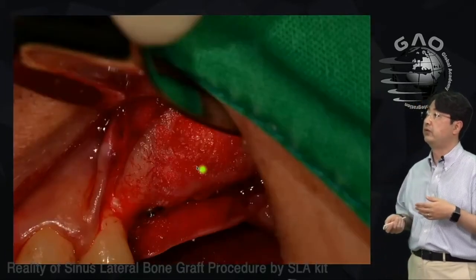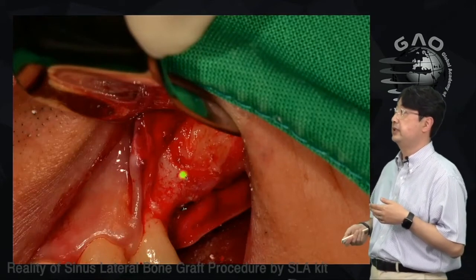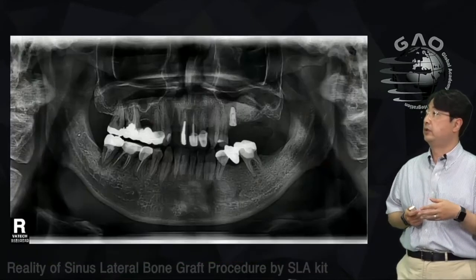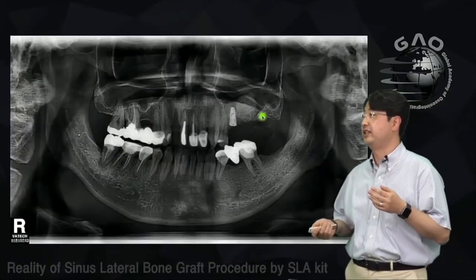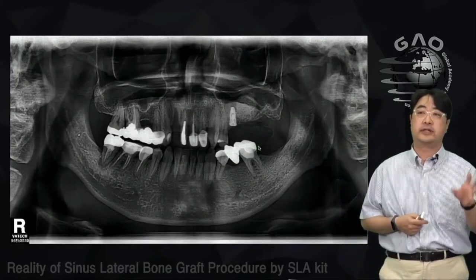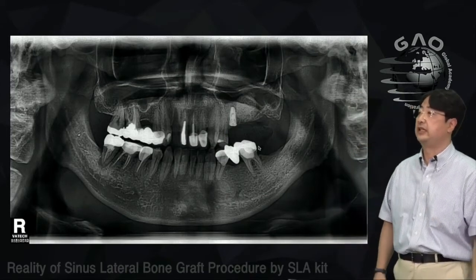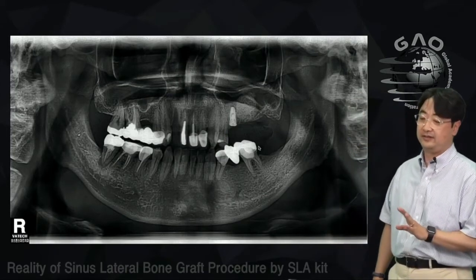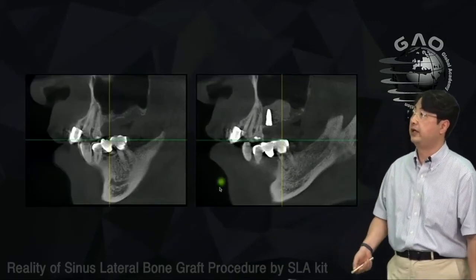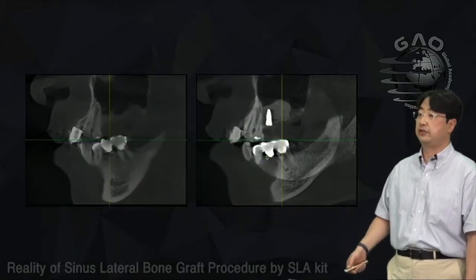I dissected the membrane using the same technique shown earlier, did the bone graft, and placed the implant, then covered with sutures. I haven't placed implant for number 27 yet — I'll place it later. This way you can mix and match crestal and lateral approaches together to handle sinus bone graft in different situations. Here is the CT scan before and after.